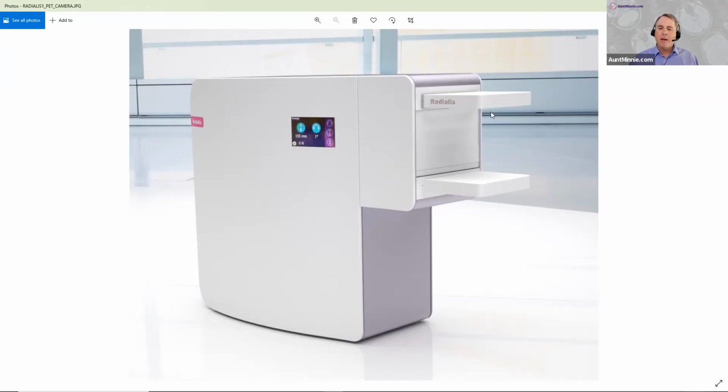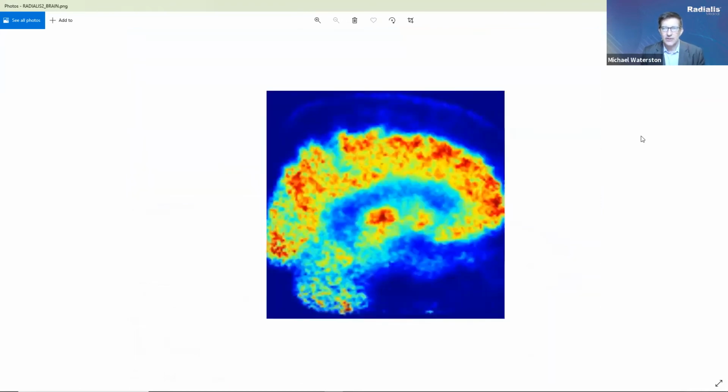Almost looks like mammography paddles. Yeah, exactly. They do look a lot like mammography paddles, and we've just been able to give them some more flexibility in positioning to be able to be used for other applications as well.